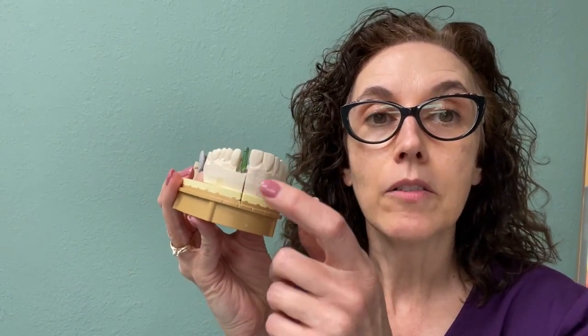Or now that we have my fabulous scanner, the other option is to put something in called a scan body, which looks similar to that impression coping. But instead of taking an impression, then we would send it to the laboratory by the scan. So it's all sent electronically. Really neat stuff.